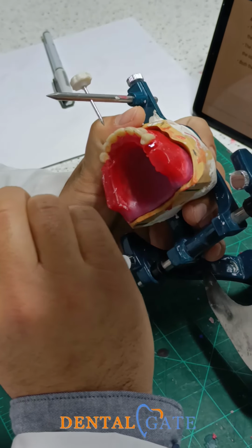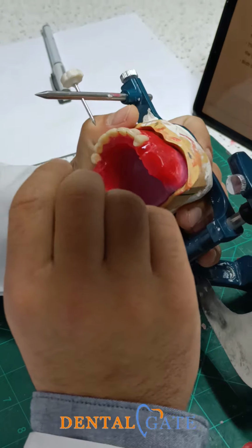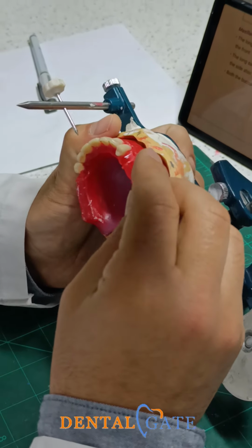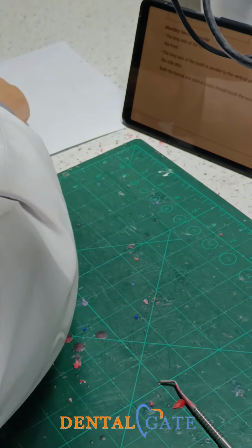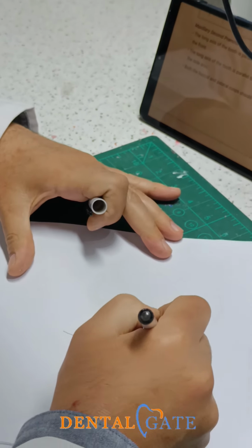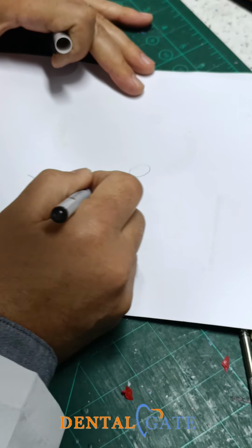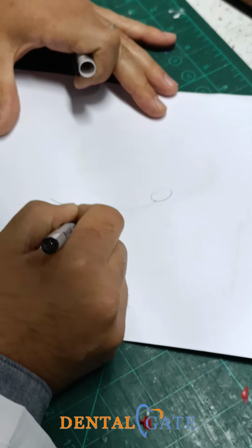The lower should be arranged according to the upper, with one condition. The upper should be arranged with the table. So the two cusps, what should they represent? Why do I connect two cusps with the table? For the upper, I want to make that curve toward the maxillary tuberosity, okay? This is our curve in the upper. For the lower, this is the anterior teeth, I will make another curve here.